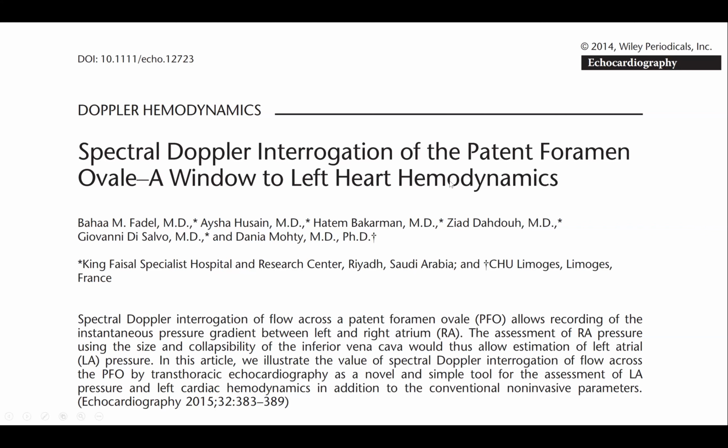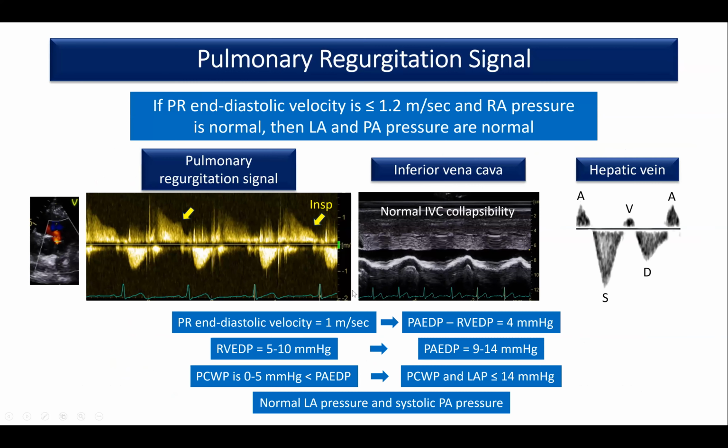Looking at this patient, for example, you can see this is a systolic wave, this is a V wave, a reflection of a V wave in the left atrium. You can tell the patient has a large V wave in the left atrium. So, you're welcome to read the paper. It really gives you a lot of insight. So whenever you see a PFO, Doppler it and use it.